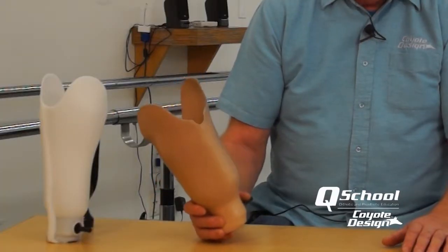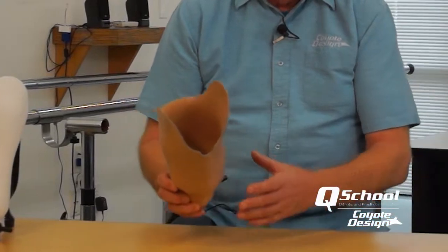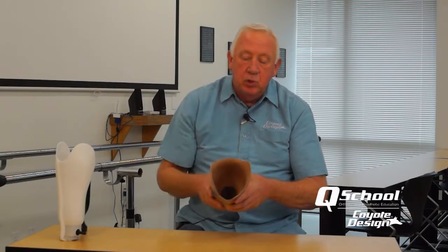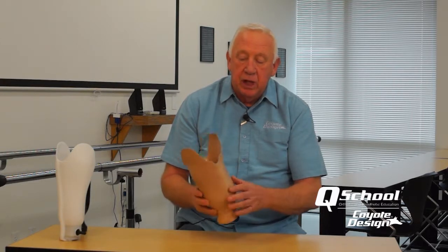The original concept of the stable flex socket started out trying to develop a socket system that works well with pin lock systems. Based on my own personal experience with prosthetic wear, we really made an attempt to totally eliminate the pressure on the patellar tendon and have a much more narrow ML design and a much wider AP dimension to allow easy engagement of the pin and really eliminate the pressure on the patellar tendon.